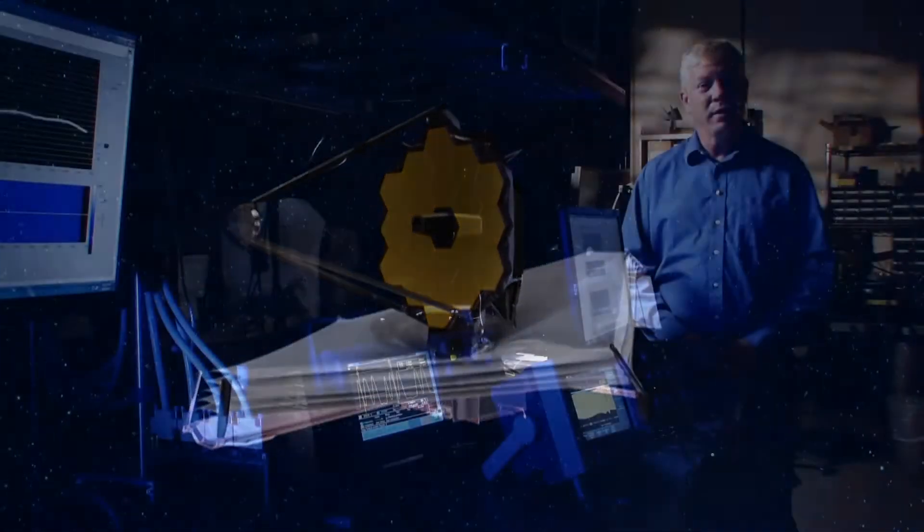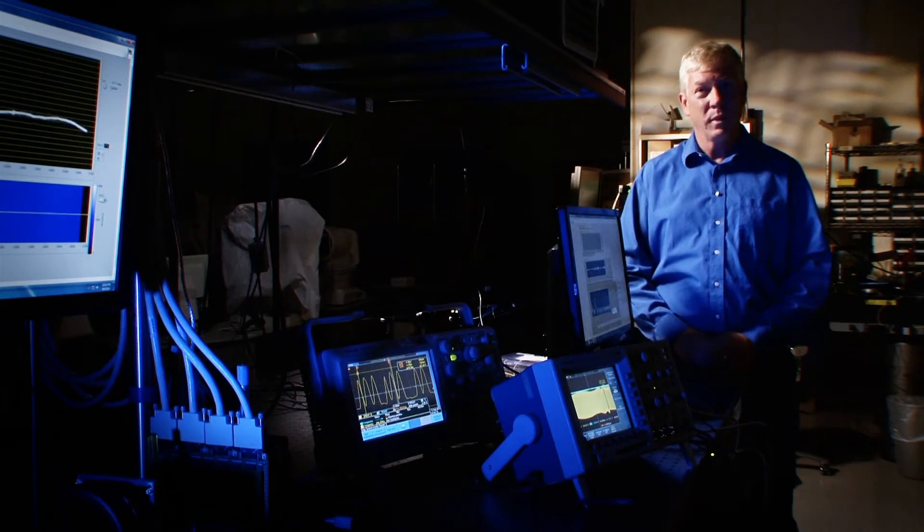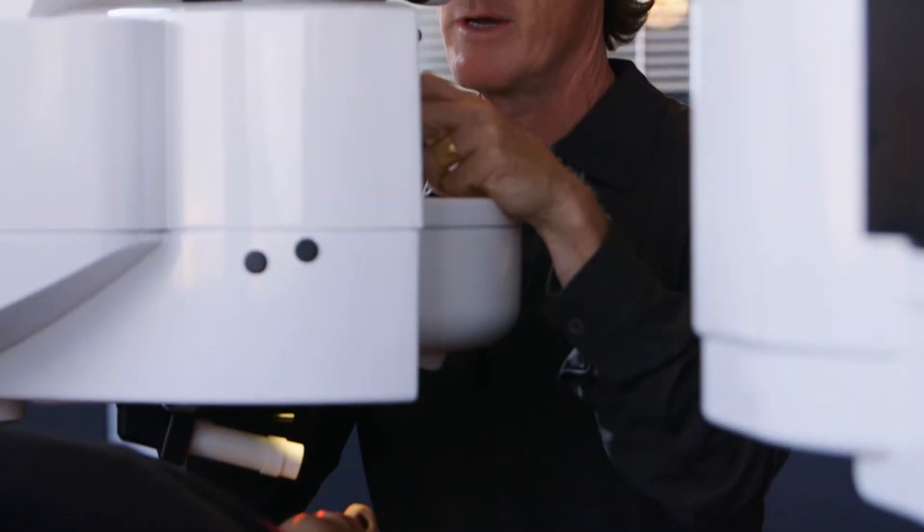The thing I'm most proud of is that we've been able to improve the vision of so many people. Bottom line is, I think there have been millions of LASIK procedures that have had a better result as a result of our technology.